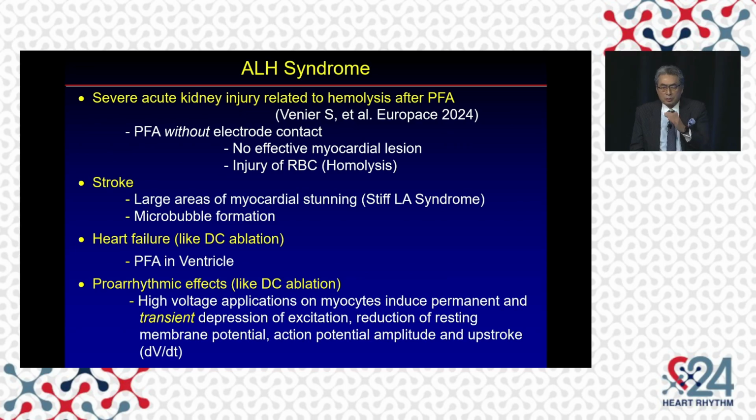PFA without electrode contact is not making an effective lesion. However, you are injuring red blood cells effectively. That is a problem. And as you know, if you ablate like hell for 30 minutes, you can eliminate the entire left atrial potential. But resulting in ALH syndrome, maybe stroke risk increase. You're talking about DC ablation, maybe heart failure.